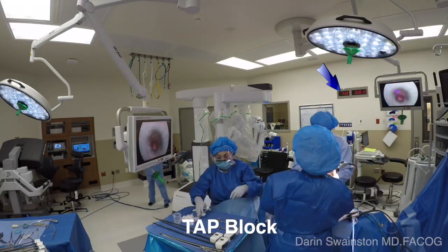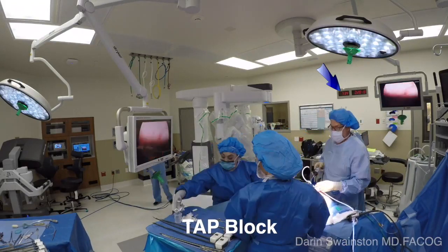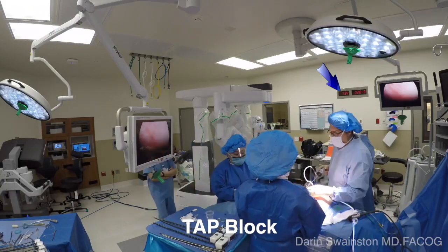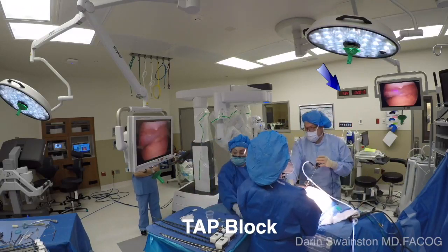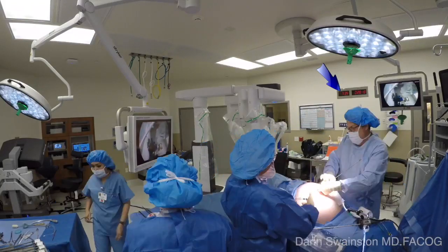She's going to position the arm — she has it all ready to go. Meanwhile, we're doing a TAP block for pain control later. After the completion of this, you'll see us position the patient in Trendelenburg and lower the table, and the nurse will be ready to immediately bring it in.